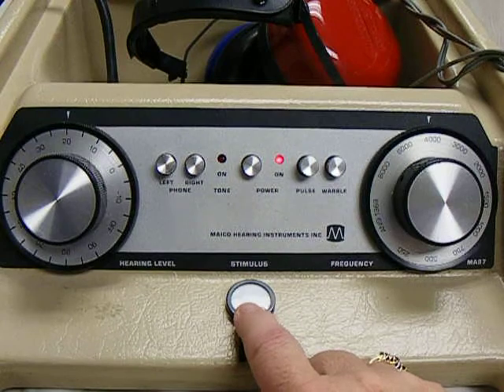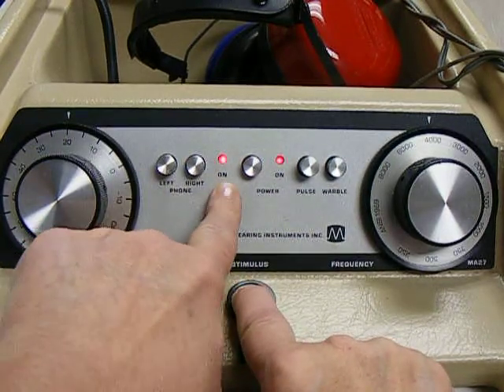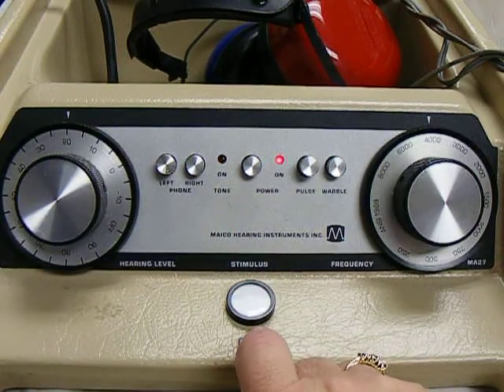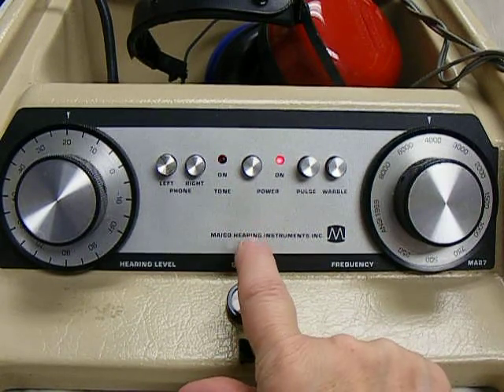This button presents your tone. When you depress the button, the light lights up. You will want to present a tone from one to two seconds.